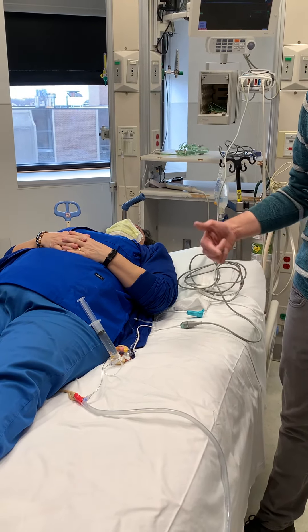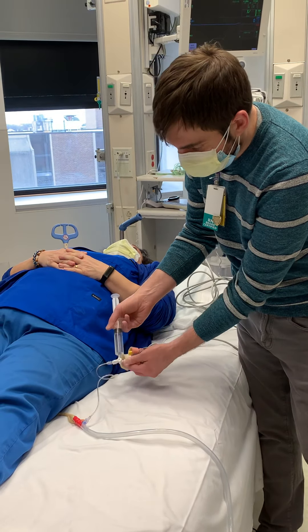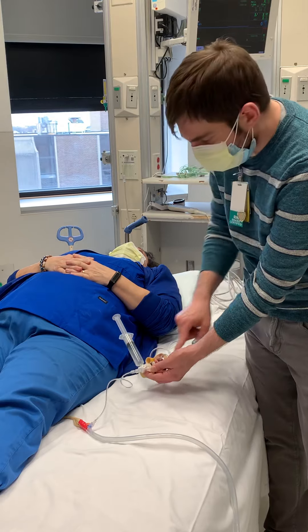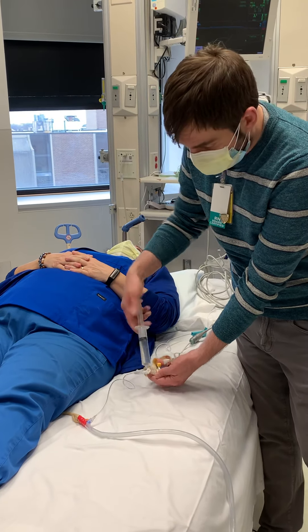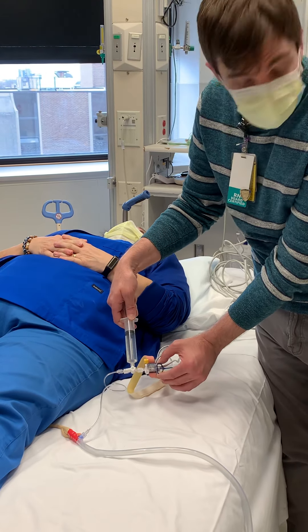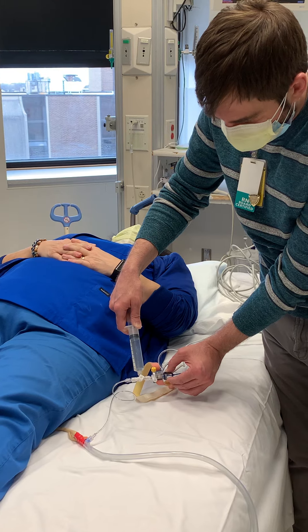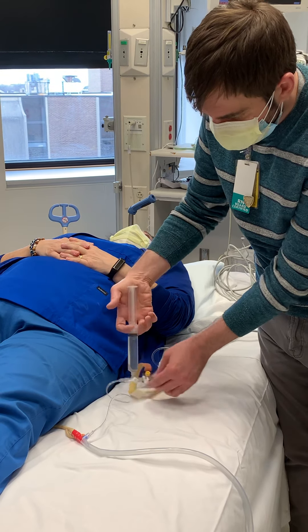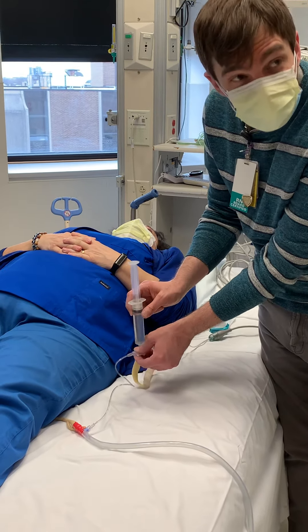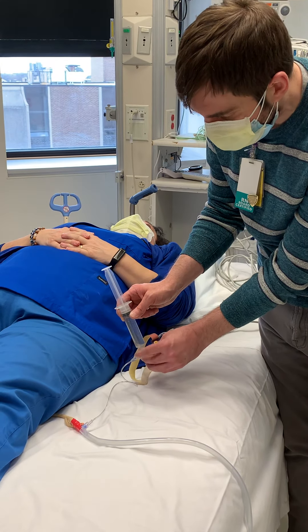Now, to actually do your measurement, you're going to turn your stopcock so that the bag is open toward your syringe, and pull back until you get 25cc's of saline in there. It's a little tricky because you have to squeeze the flush and pull back at the same time to get the fluid to come through. It's a 30cc syringe, but you only need 25cc's.